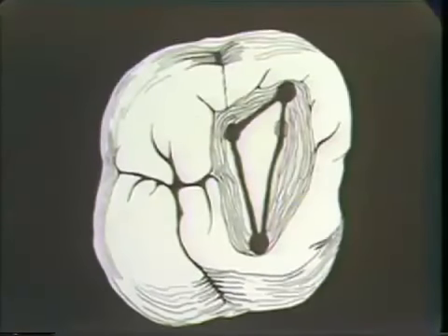The maxillary molars present a little bit more problem for students. You're farther back in the mouth and you have to get oriented to find 3, sometimes 4 canals. This is an occlusal view of a maxillary molar with an endodontic access preparation that has been prepared. As you can see, there are 3 and then sometimes a 4th canal. The first canal is the mesial buccal canal. It sits almost directly underneath the mesial buccal cusp, very much to the buccal and somewhat to the mesial.